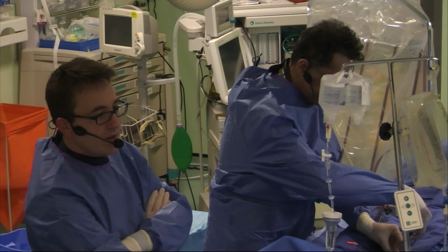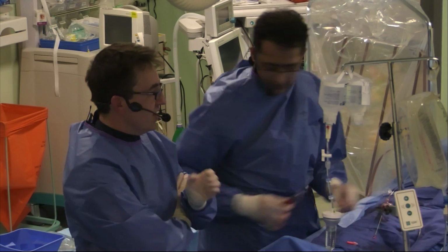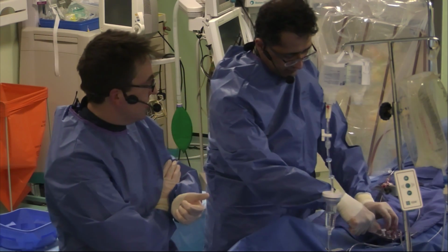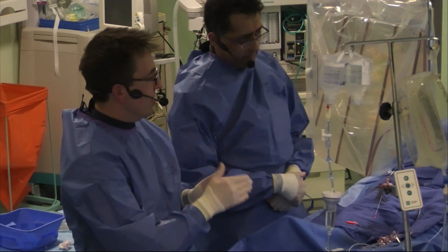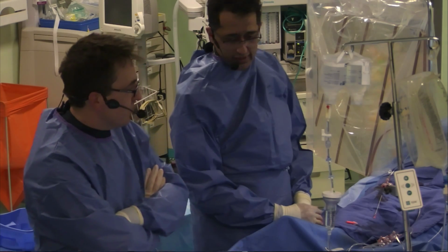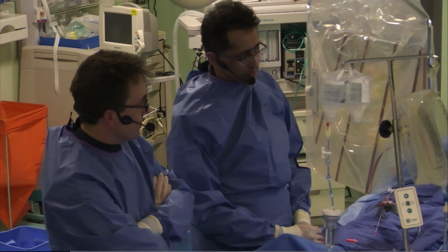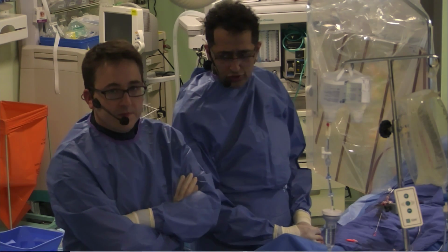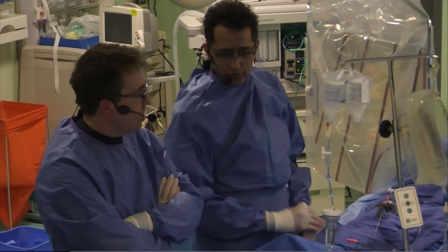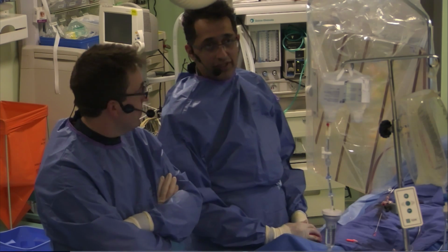Great. Okay. So you seem to me pretty dogmatic in terms of your use of nitrates, your attention to detail with repeat normalization. Is this because you see lots of drift, or just because you know that this is the best way of making physiology measurements? I think that unless you are meticulous, then it's rubbish in, rubbish out. So if you make measurements which are hurried, you don't understand the physiological basis of them, then you can't interpret the result. And so, you know, occasionally wires will drift. You need to understand that, and you need to know the clinical background of the patient. So I think we mustn't always forget the patient.